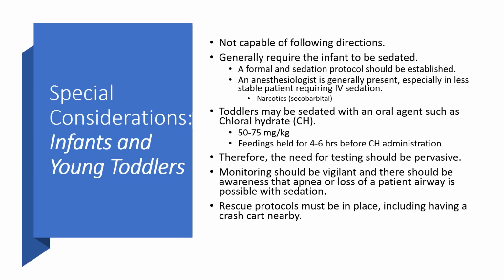Now we talk about young patients. We could be talking about infants, young toddlers, young adolescents, older adolescents. So I deliberately, and I did a little bit of cherry picking here, took a look at some of the special considerations in this particular slide for infants and young toddlers. This patient population is generally not capable of following directions, and generally requires the infant to be sedated.